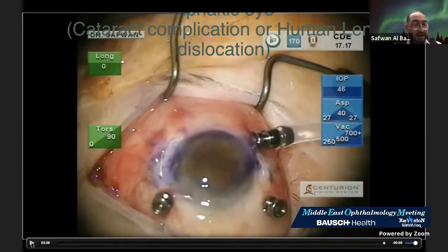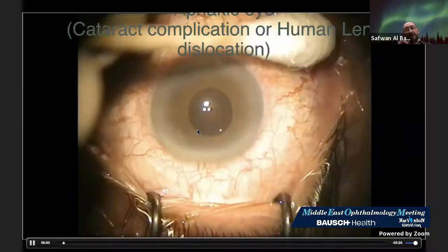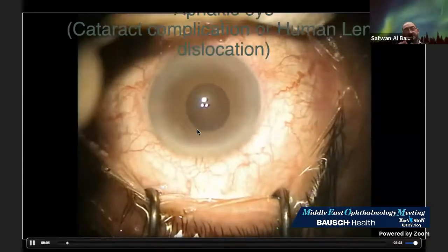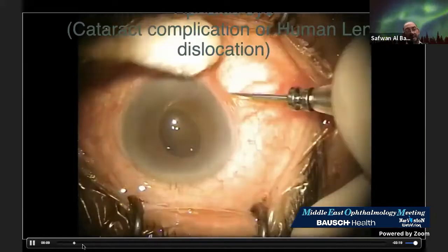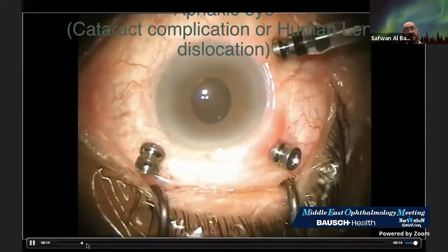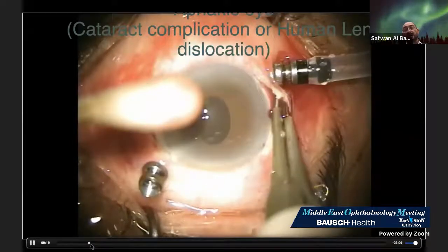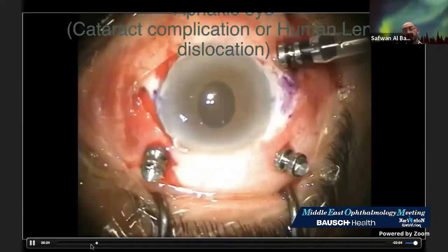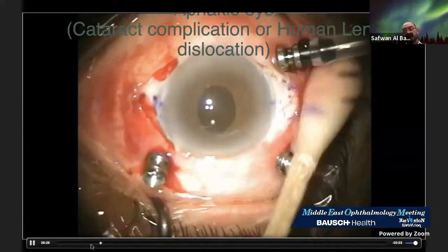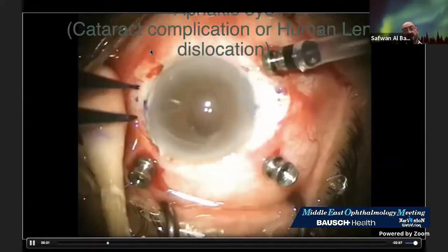Now, I think I have the right to return it back, and it will be now a very quick movie. And you can see the tips that I mentioned. This is a vitrectomy. We can skip this side, and you can see the peritomy. The marker is very clear on 3 and 9. 2 millimeter from the limbus, 3 millimeter away from each sclerotomy here.